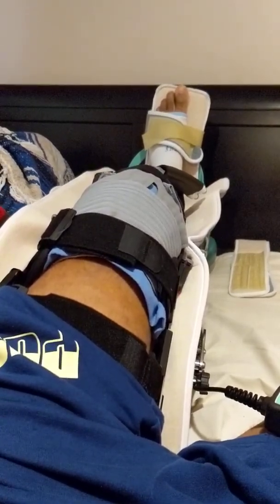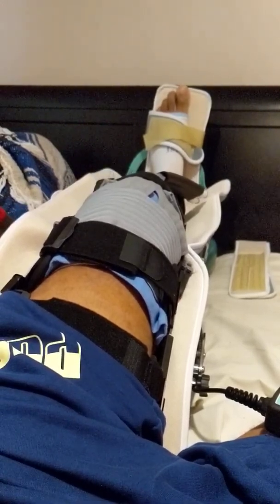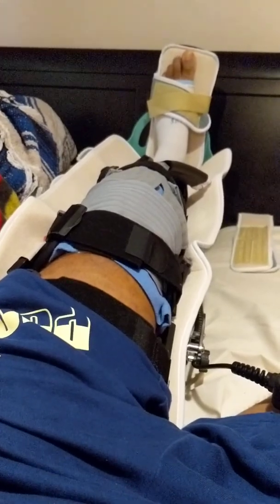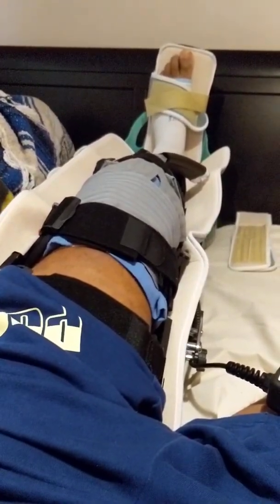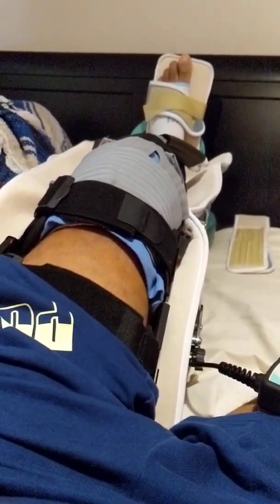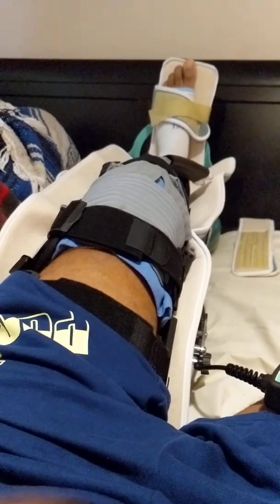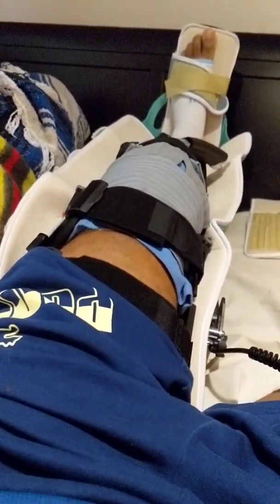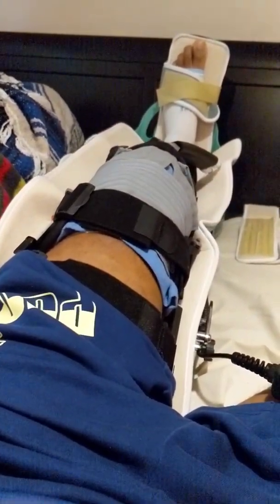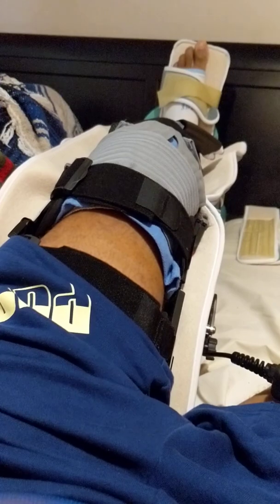We don't know yet because I've never been through this before, but we're going to push it — the right way. We don't want to push it too hard. This is day two, the day after surgery. I'm supposed to do this six hours a day — either three sessions of two hours or two sessions of three. Since I just got the machine and I already had plans, I'm going to do this for one hour and then go outside, try to move around and get some shots up, keep that blood flowing. We coming back strong.